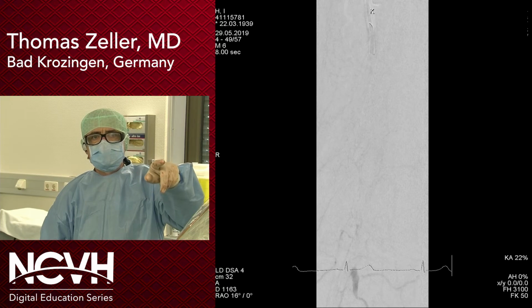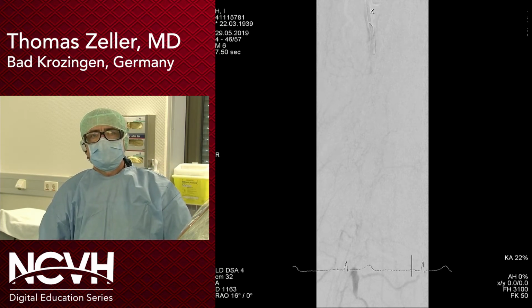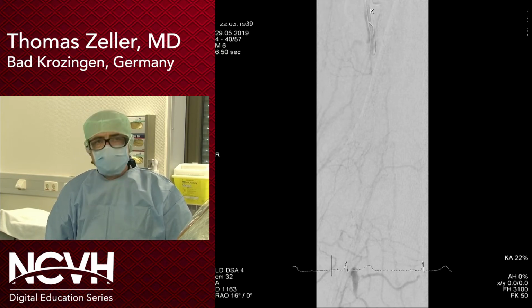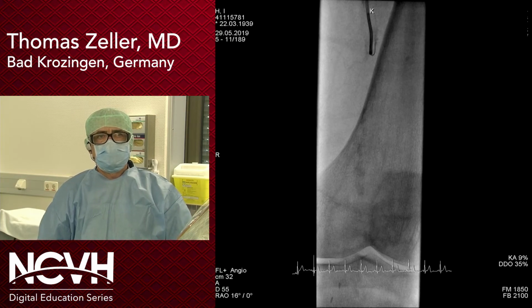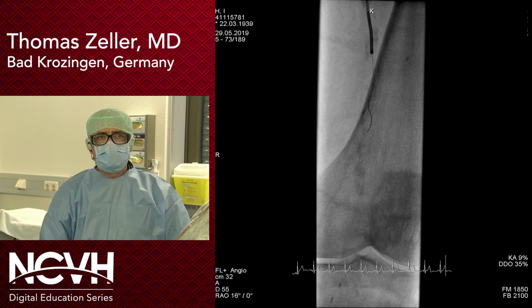Well, it's a very short segment, but still patent. And the guide wire I did use for the crossing attempt is an 0.018 Advantage Glidewire. And you may see here in this run that I was most likely able to cross the lesion in the true lumen, even if it kinks a little bit, but here it's going down again.